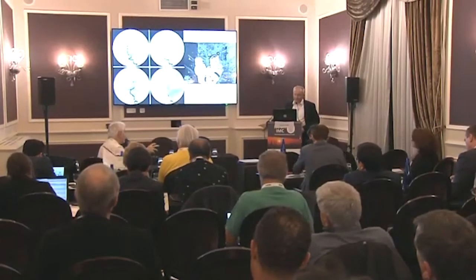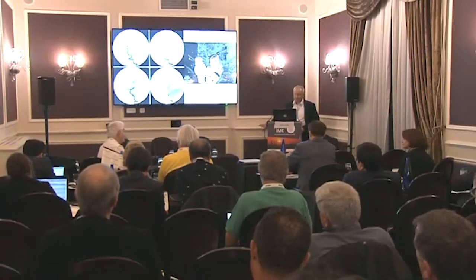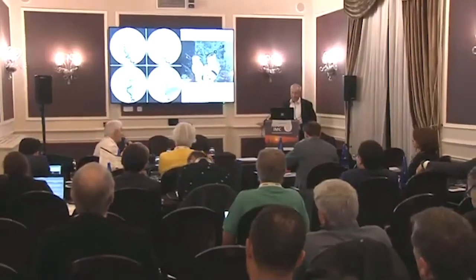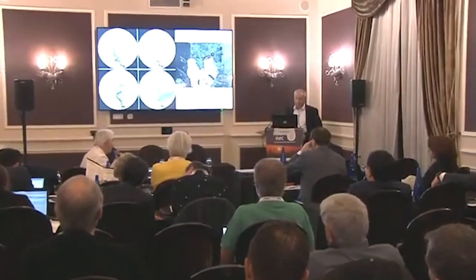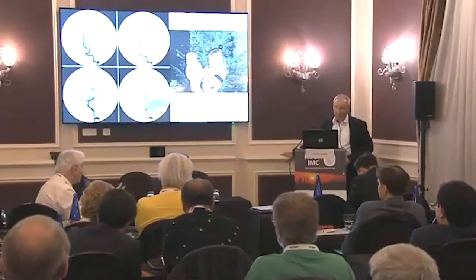The point that I disagree with is the regular strategy for the treatment of vein of Galen and your position: you have to occlude the venous system. Attacking the vein of Galen from the venous side is not a shame. It is exactly what you have to do. Occlude the vein. You can do it from the vein or from the artery, but you have to occlude the vein. If the baby is 2 days old, you take an artery, you decrease the flow, you pass the cardiac failure, but then you don't wait. After 2-3 weeks, when the baby is fine, 1 month maximum, you go and you occlude everything.